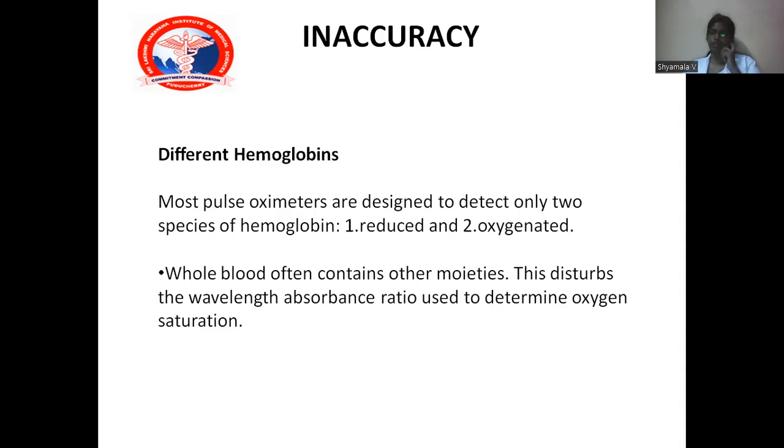For esophagus and forehead, we use the reflectance type of pulse oximeter, and it is affected by the steep Trendelenburg position. The esophagus probe can be used for patients with hemodynamic instability. So coming to the uses of the probes, we can use them for monitoring during anesthesia care, including all types of anesthesia like regional anesthesia, monitored anesthesia care, endotracheal intubation during induction as well as emergency, and during one lung ventilation.